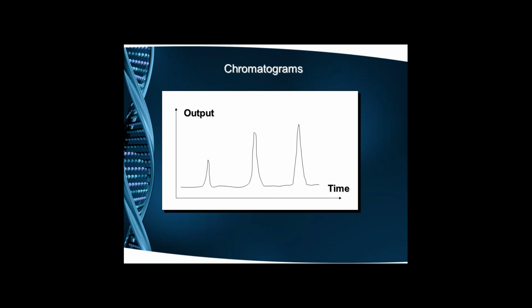So there are various peaks in this graph. Next slide, sir. And there are various peaks in this graph, and these are the peaks which give a presumptive diagnosis of what it is. Next slide, sir.